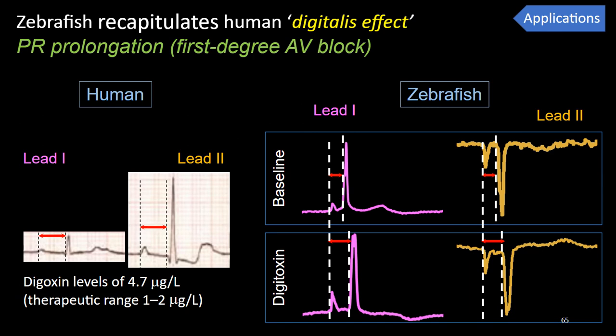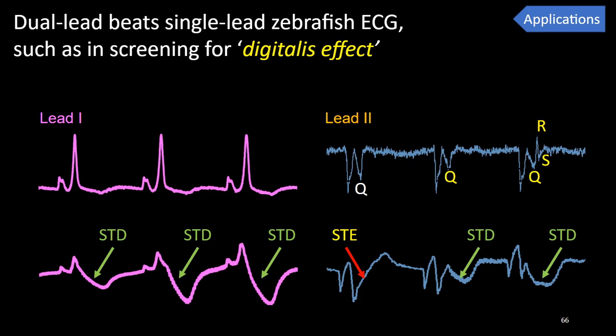The finding of differences between leads 1 and 2 in reflecting certain DIG effects underscores the benefit of assessing drug effects from 2 leads, thus capturing both a heart long and short axis instead of from a single lead as in current practice.